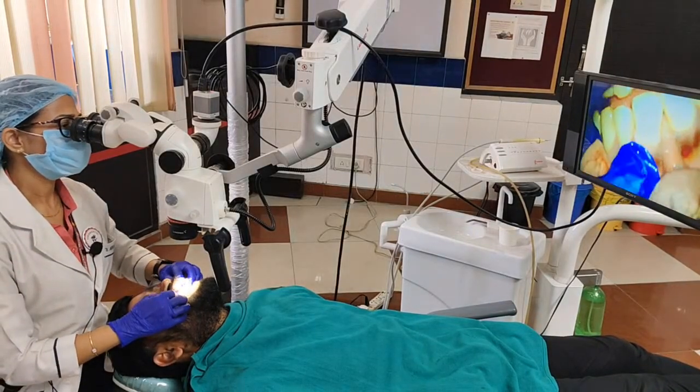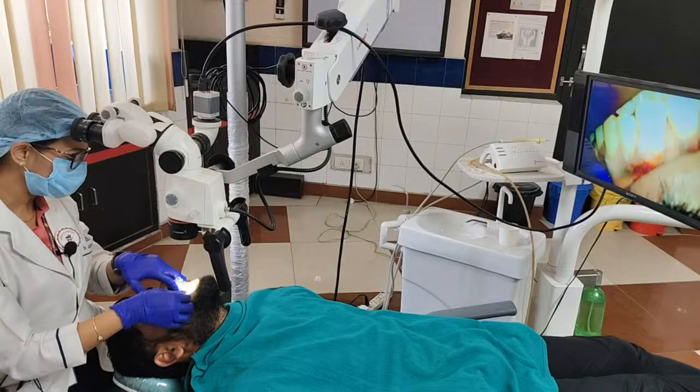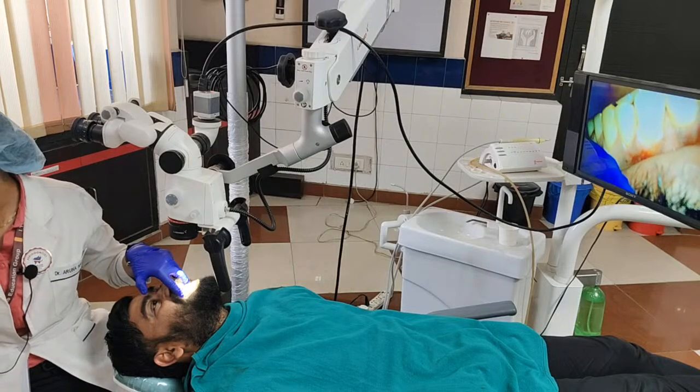Okay. Is it visible to you? Yes, ma'am. Okay. A little more remaining. Probably I'll change the blade once more. Anushka, can I have another blade, please? Till then, you give me that one. I'll work with that till you change it.